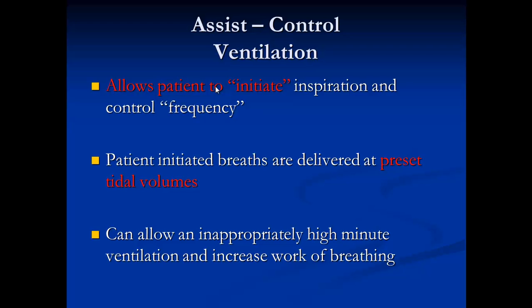However, if the ventilator and the patients are not in synchrony, or if the ventilator inspiratory flow rates are not matched with the patient's demand, this mode of ventilator support may lead to a significant amount of patient work.